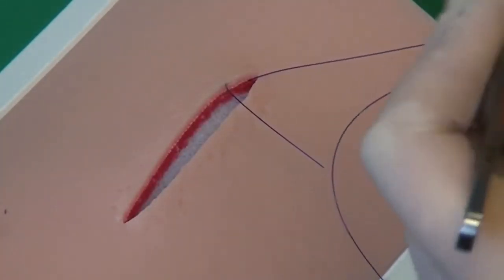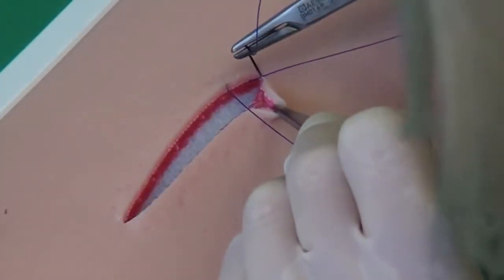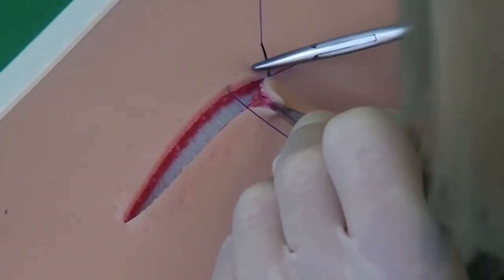To prevent the suture pad from damage, anatomical forceps are used instead of surgical forceps.